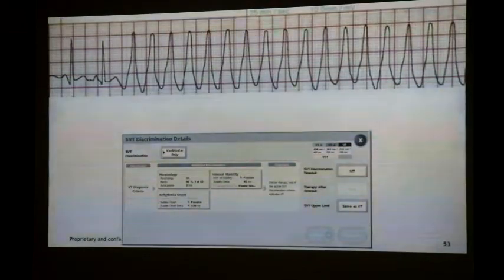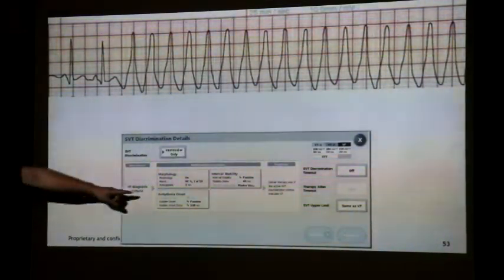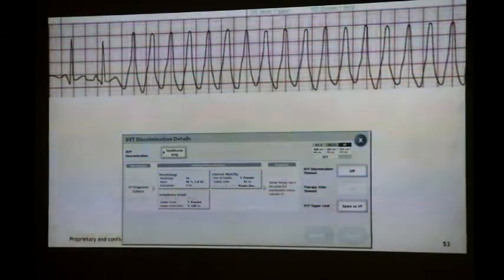Your primary prevention patients have got depressed ejection fractions, they're on beta blockers, their chance of getting to 180 in sinus tachycardia is 0, or pretty damn close to 0. So therefore, sudden onset in that population is pointless because they don't have sinus tachy. So it's only going to get it wrong.